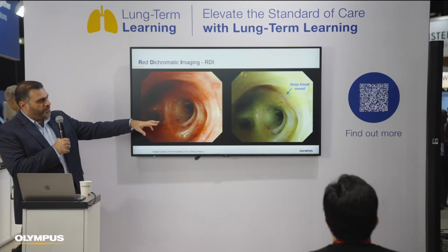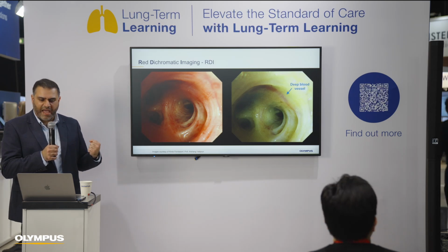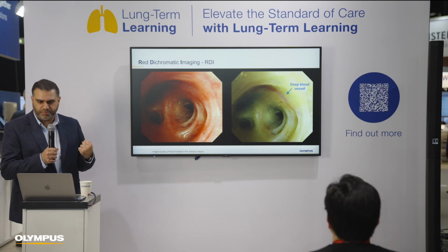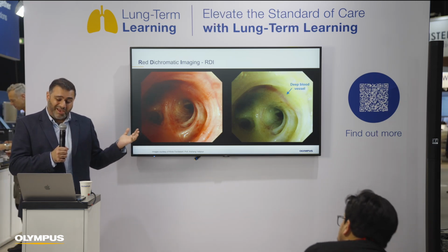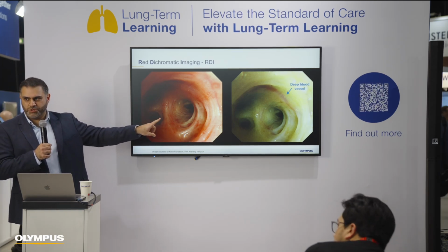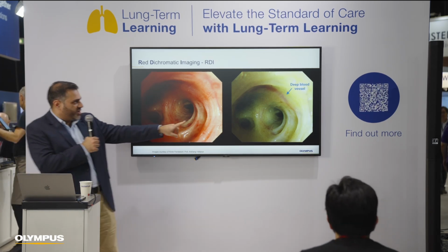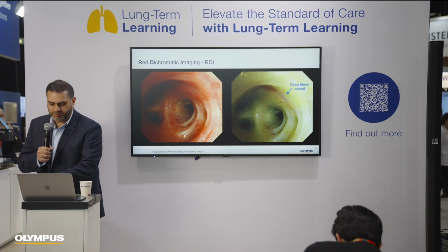Where there's a big concentration of hemoglobin, i.e. a blood vessel, or a deep bronchial artery like here, a lot more of the red is reflected back and some of the amber wavelength is absorbed by the blood. So we see a much, much darker red image. Look, we know we're not going to biopsy anywhere in this area, but if you saw something like this, you'd want to avoid doing a biopsy there because you know that's going to create bleeding.